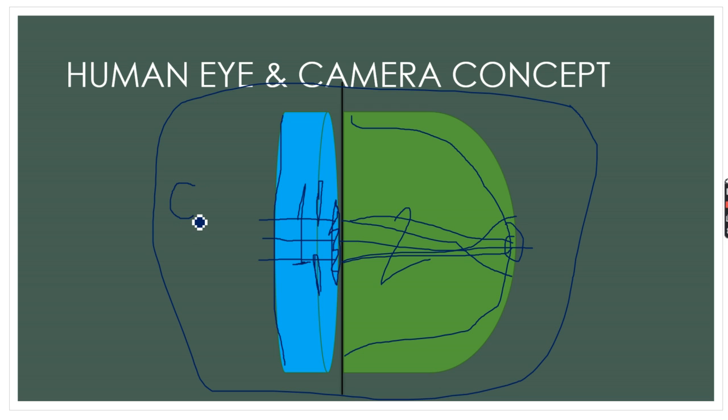So this first zone is basically the coupler in our camera head, and the second zone is the CCD in our camera head. Almost similar, right? What does it mean, almost similar?